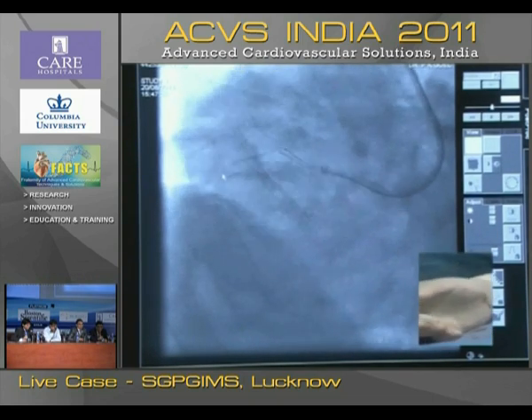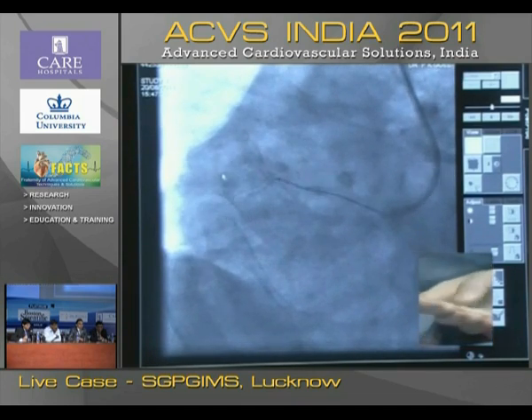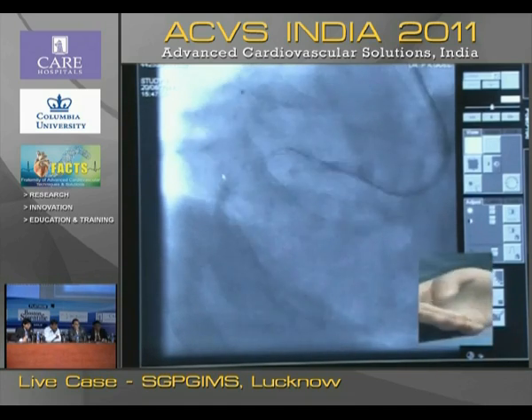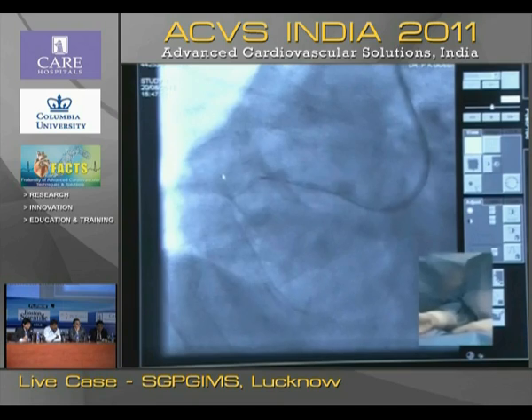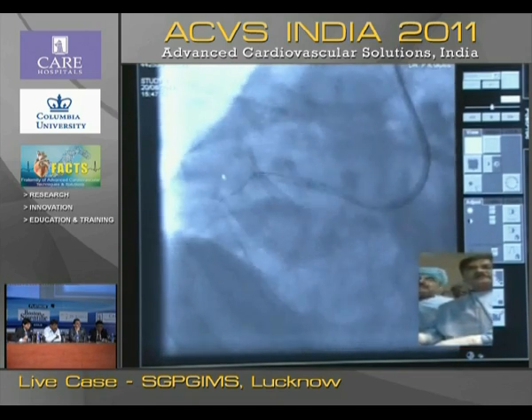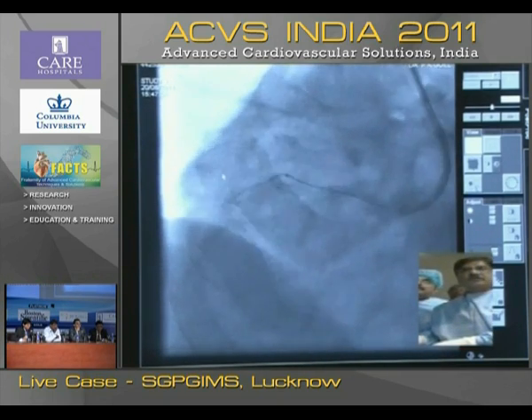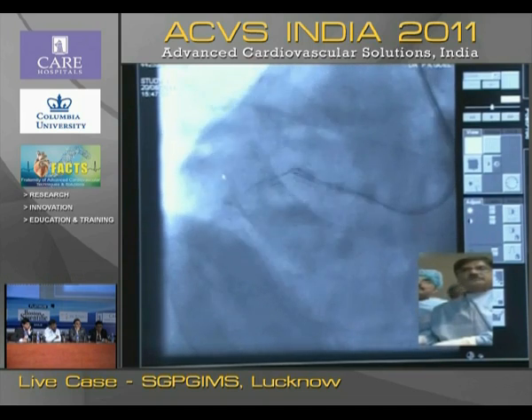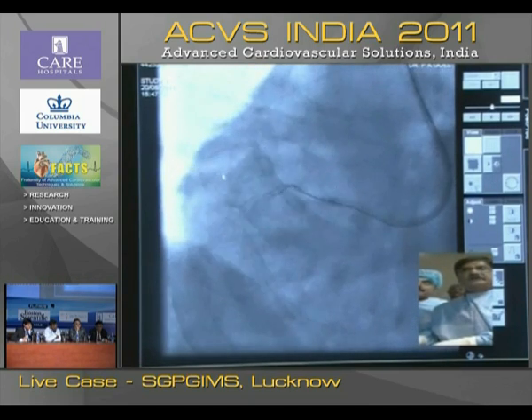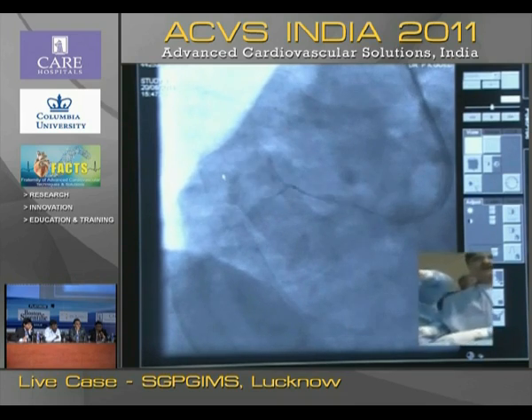If you can show my hand, is it backing up? Test please. It has crossed the bend. So now what I am doing is just rotation and letting the wire go. Just rotation, no pushing. It's traveled a great lot already.